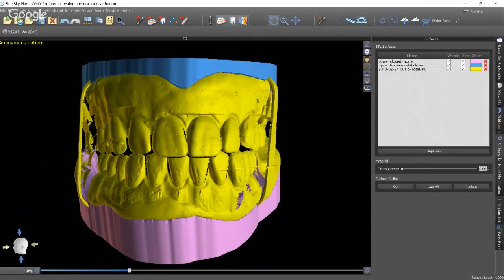What are the other ways you could do it? You could just as easily use an intraoral scanner. I've not done this personally, but I've seen, for example, Armin Rezaian do this with a CEREC OmniCam. Dr. Valerie Cooper, I've seen her do this on her Instagram page using the 3Shape scanner. So I think many of these scanners are capable of scanning the interior of the denture to generate the model, and then once again wrap over on the facial surface enough that you capture that buccal data to, one, give you reference for landmarks for setting your teeth, and two, to be able to stitch it with the buccal bite.